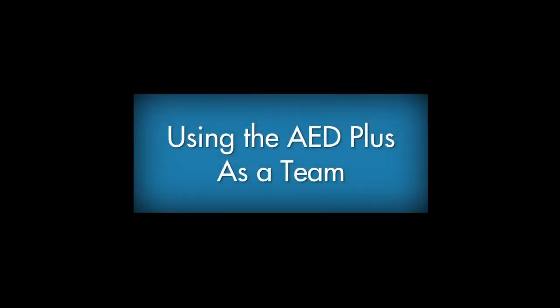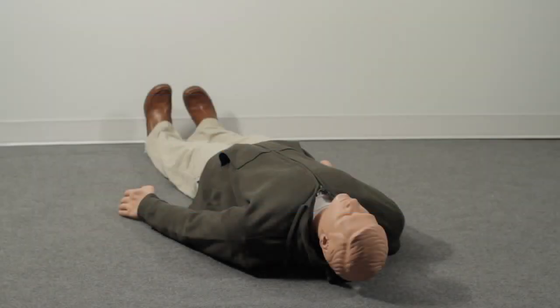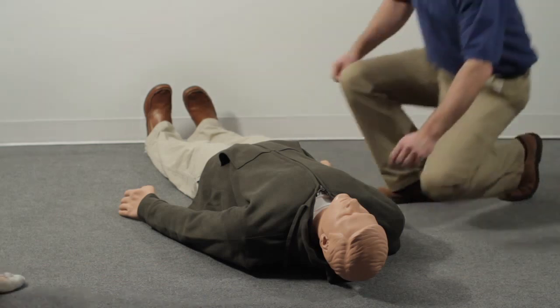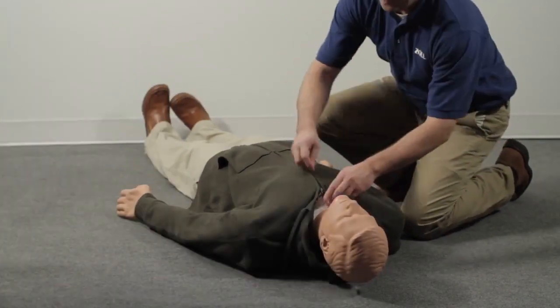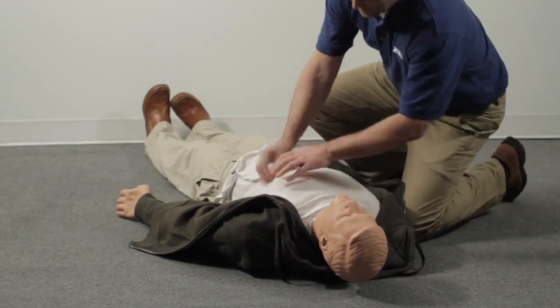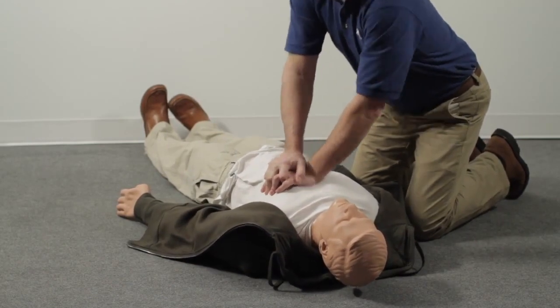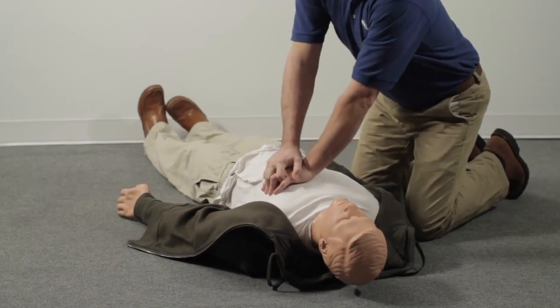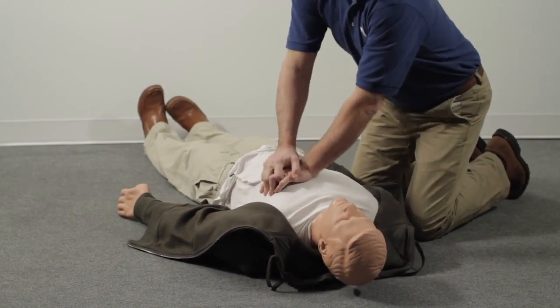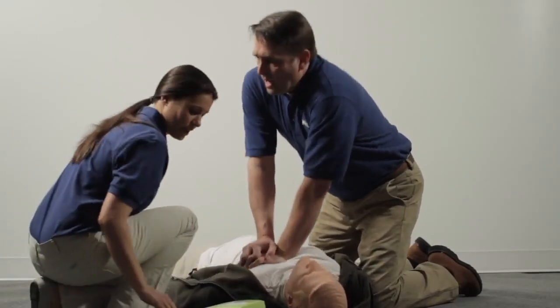Using the AED Plus as a team — let's look at a situation where an AED is used in a team rescue with more than a single rescuer. At work, you see a person fall to the floor. Check to make certain the person is truly unresponsive. Immediately send a co-worker to call 911 and get the AED. If the person is unresponsive and not breathing normally, expose the chest, place your hands between the nipples in the middle of the chest, and begin chest compressions. Continue compressions and rescue breathing until the AED arrives. When it does, make sure the person isn't touching water or metal. Place the AED Plus by the person's shoulder and turn it on.